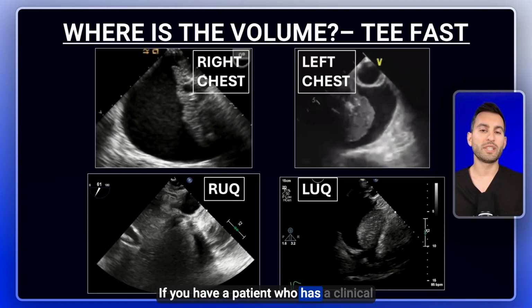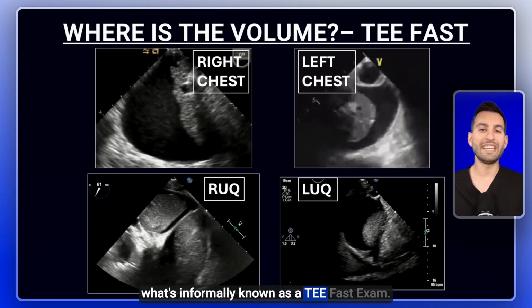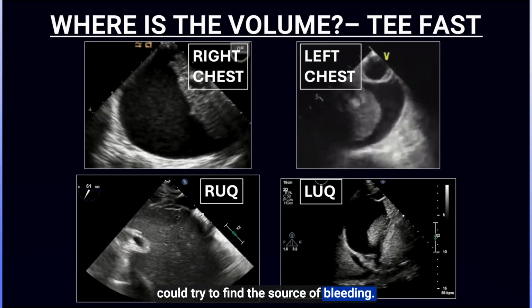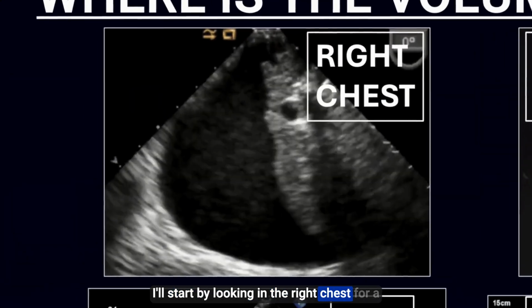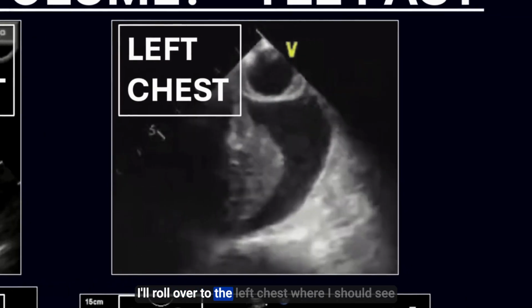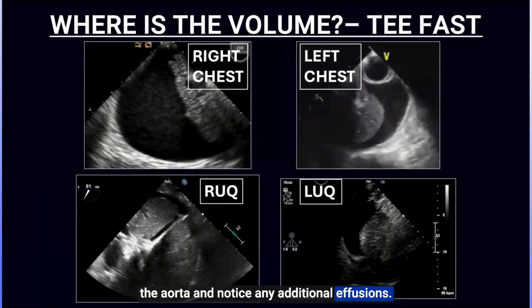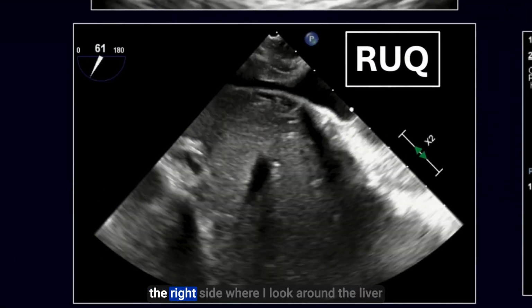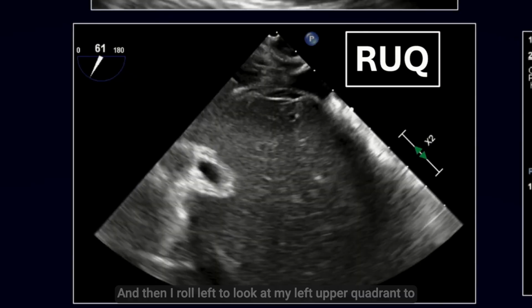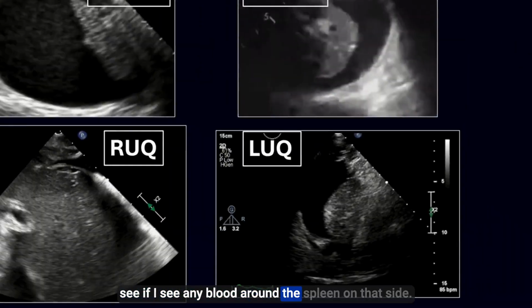If you have a patient who has a clinical picture of hypovolemia, you can perform what's informally known as a TEE FAST exam. This is a system I perform where I could try to find the source of bleeding. I'll start by looking in the right chest for a significant hemothorax, pleural effusion. I'll roll over to the left chest where I should see the aorta and notice any additional effusions. Then I'll push into the stomach and look at the right side where I look around the liver and I can see my IVC as well on that side. And then I roll left to look at my left upper quadrant to see if I see any blood around the spleen on that side.